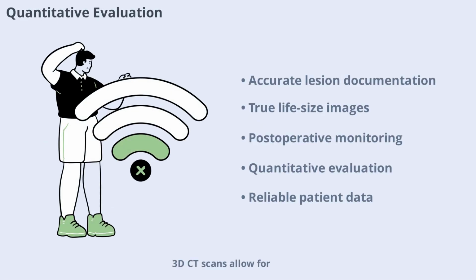3D CT scans allow for accurate documentation and quantification of lesions, yielding true life-size images. This capability is essential for monitoring post-operative outcomes and evaluating the effectiveness of treatments. The technique enables quantitative post-operative evaluation and follow-up, providing clinicians with reliable data for patient management.